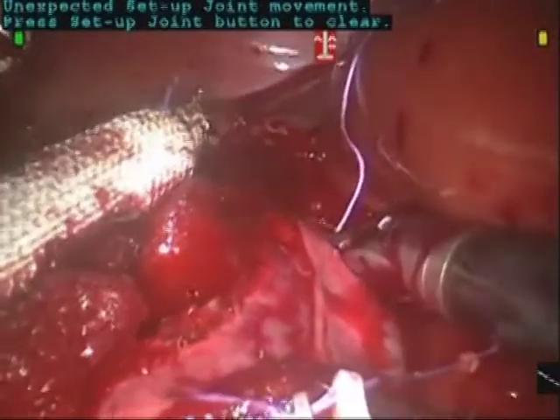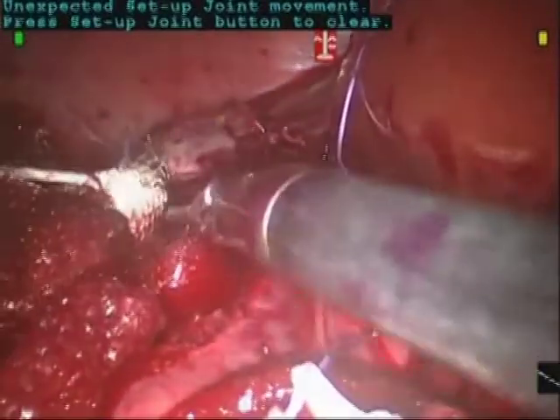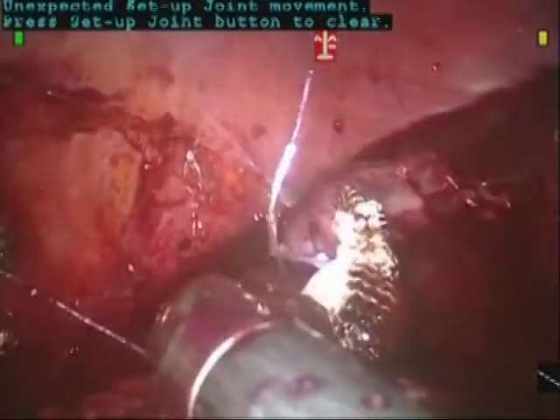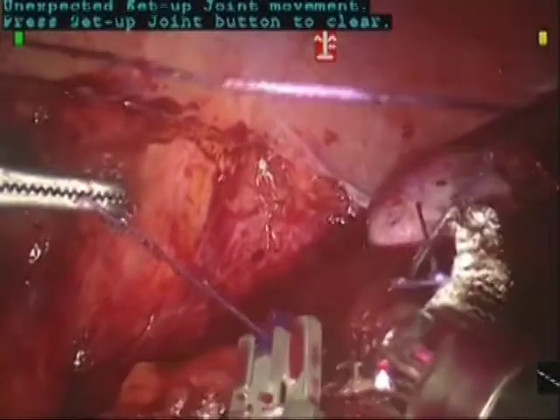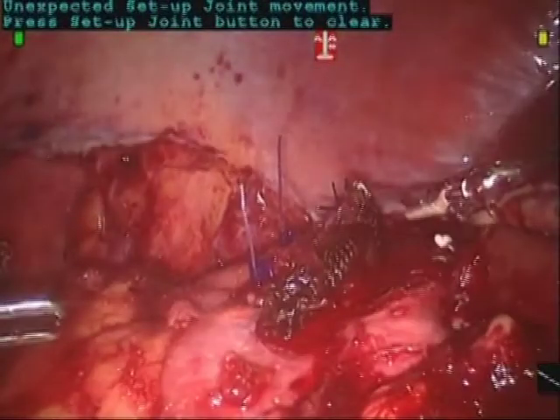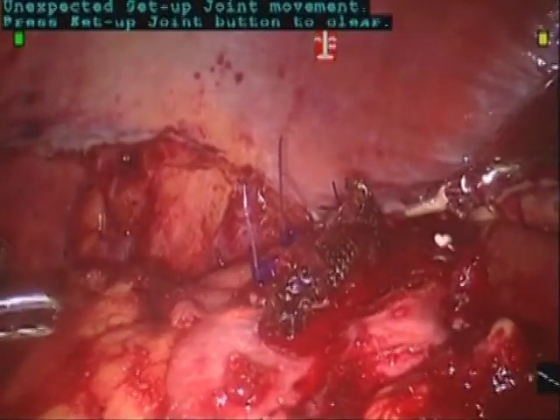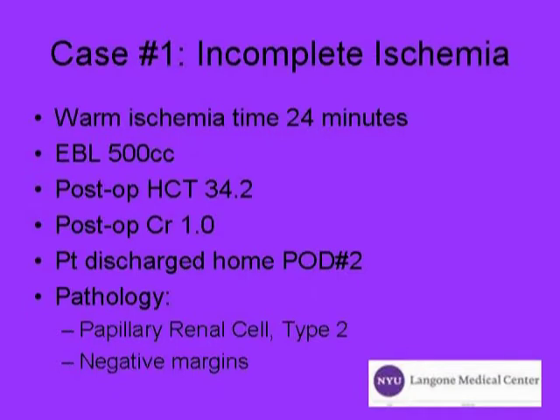Next, a surgicel bolster is placed and the defect is compressed using 3-0 vicryl sutures. Warm ischemia time was 24 minutes. Estimated blood loss was 500 cc.